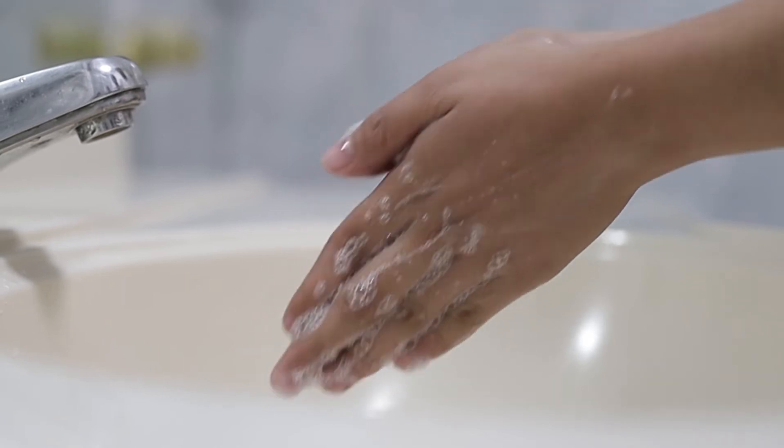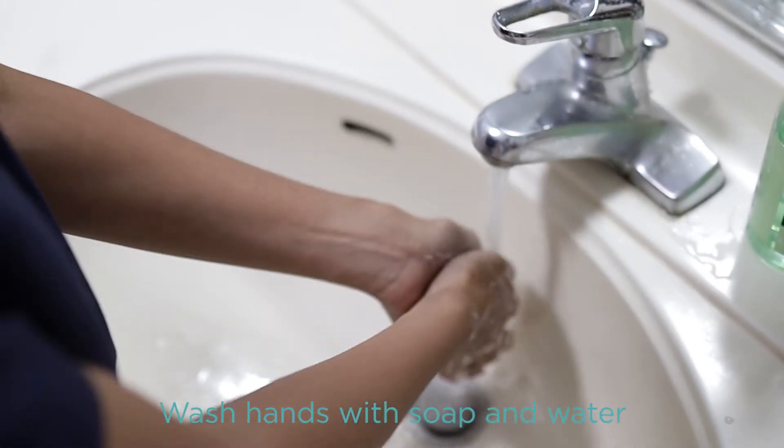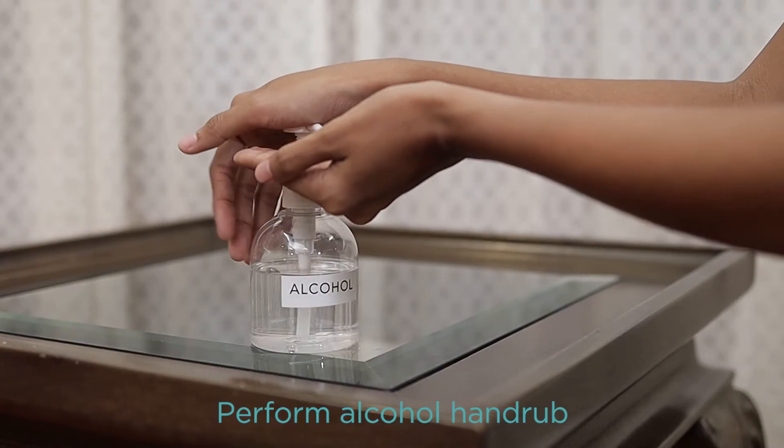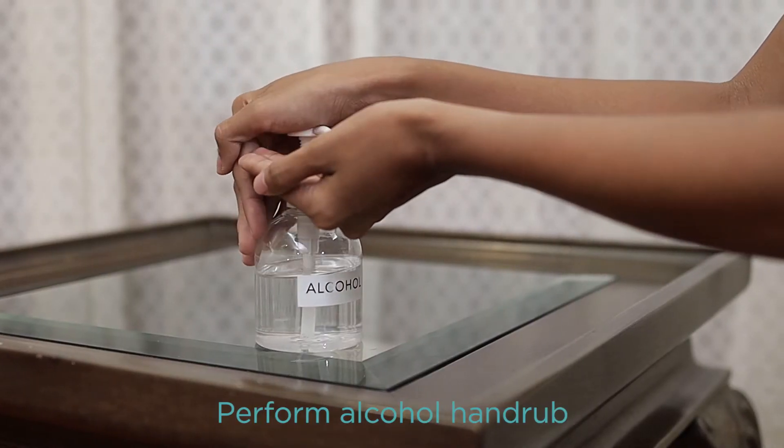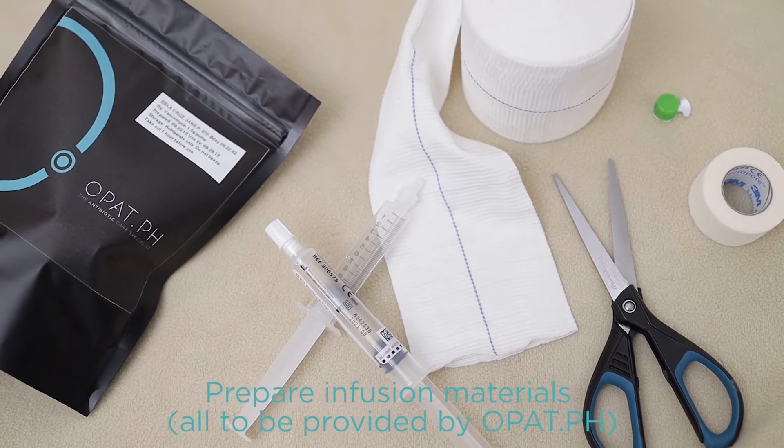Start the procedure by washing your hands thoroughly with soap and water, or sanitize by using an alcohol hand rub. After washing or sanitizing, you may now prepare your materials.